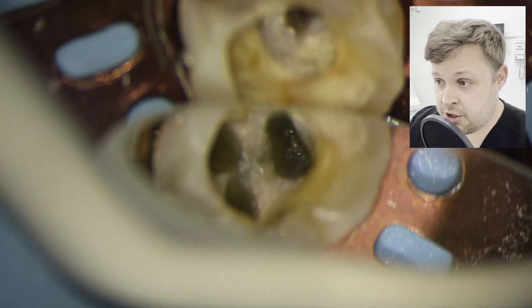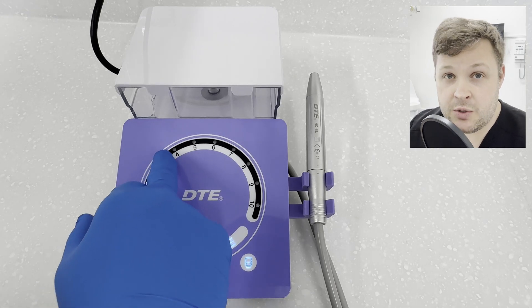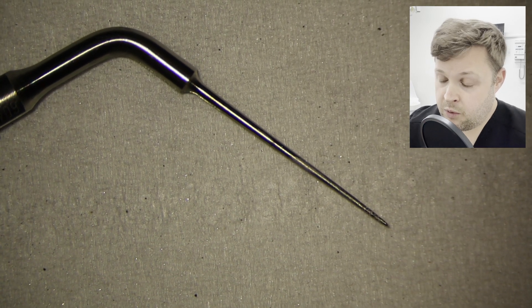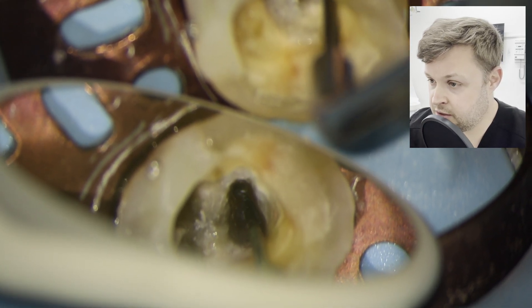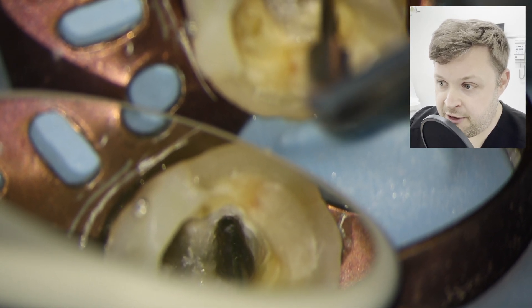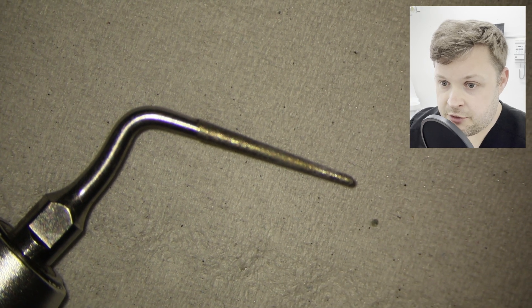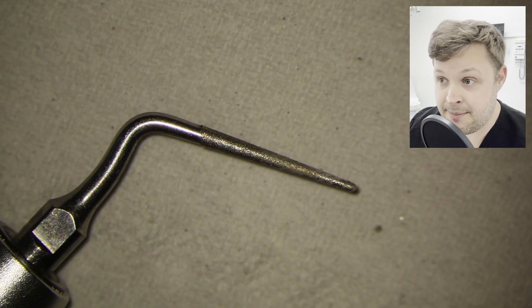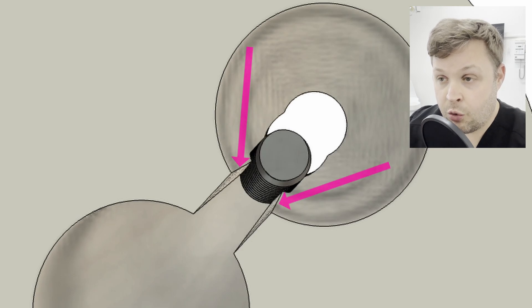So I'm thinking about what to do. I'm going to activate the file with ultrasonics — I've got this fantastic D600 unit — and I'm going to use a very, very thin ultrasonic tip on a super low setting, just to see if the file is moving at all. I'm gently activating the tooth, and in this case I can see that the fractured file isn't moving at all. So I'm thinking we're going to have to remove a little bit of dentin using this thicker diamond tip ultrasonic.